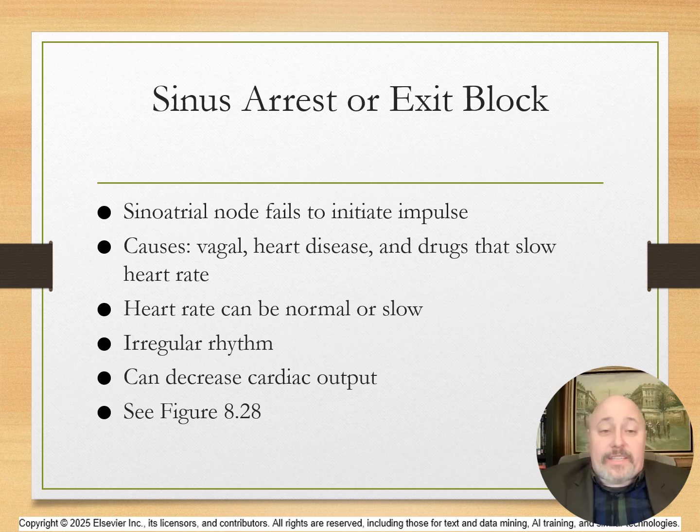On the other hand, a sinus exit block also results in a pause, but the P wave following the pause in the rhythm is on time or regular because the SA node doesn't reset. This sinus impulse simply fails to exit the SA node.